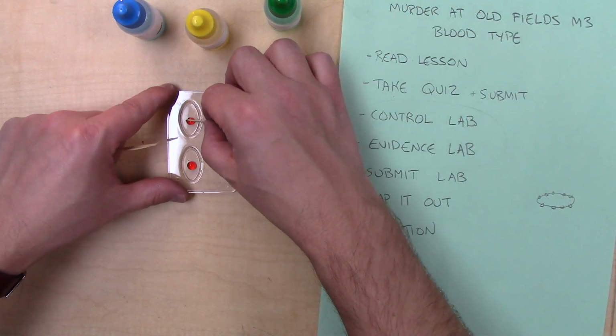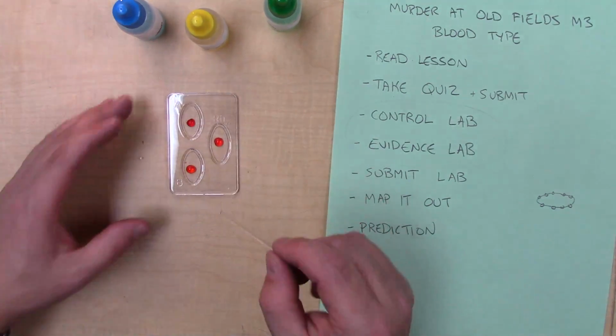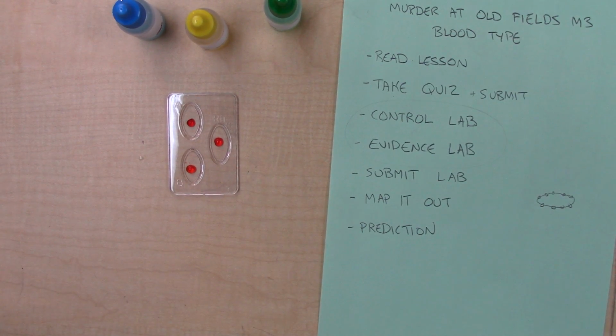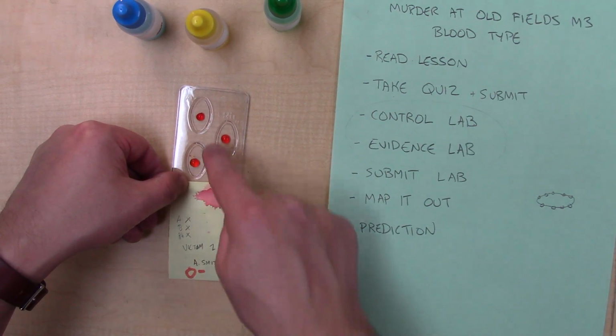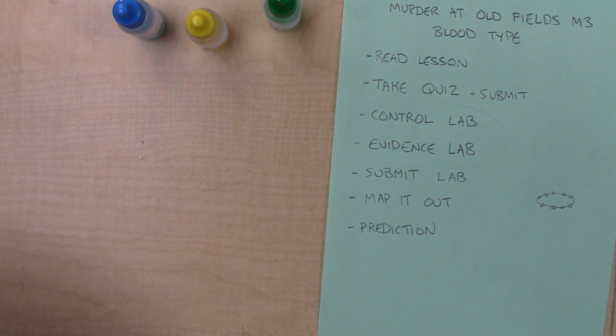Use a different side each time you stir. This is pretty wild because, look at that. It didn't react to A, it didn't react to B, and it didn't react to the positive test, which means victim 1 didn't react to any of them, so he must be O negative. Didn't react, didn't react, didn't react, O negative. Would you like to see one more?